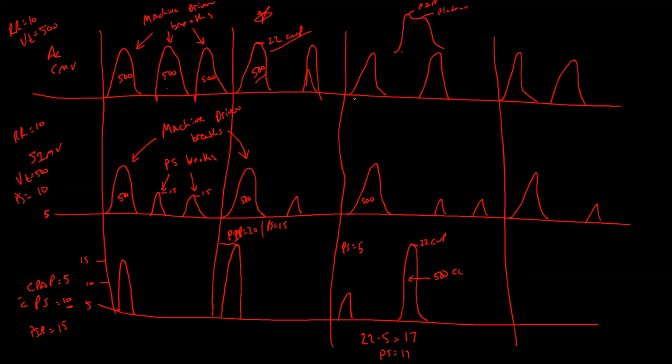Your peak inspiratory pressure is the pressure while the air is moving, and so it incorporates airway resistance into it. We know that we're going to have resistance to air movement. That's just how physics is. We can have a lot of resistance, we can have a little bit of resistance, but there is always going to be a resistance to airflow. So that's added on to it. It's measuring that. And then when the air stops and you don't have any air movement, it's measuring that pressure also, and that's where it drops off a little bit for your plateau pressure.